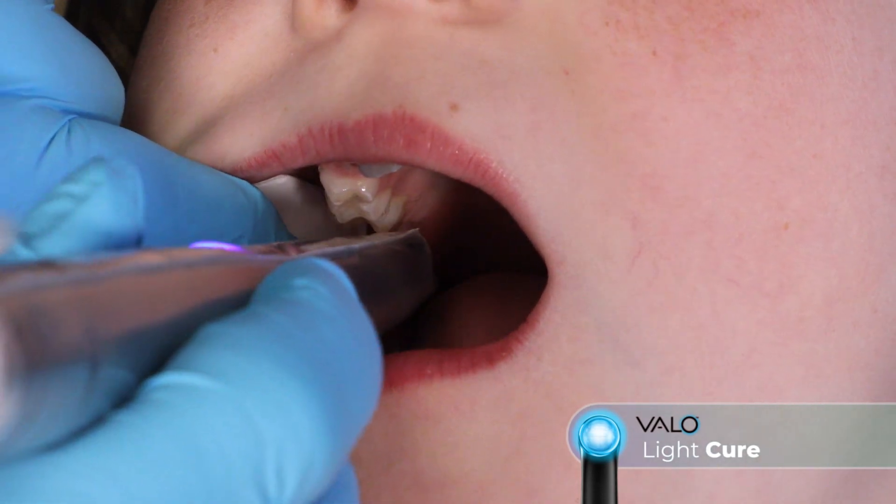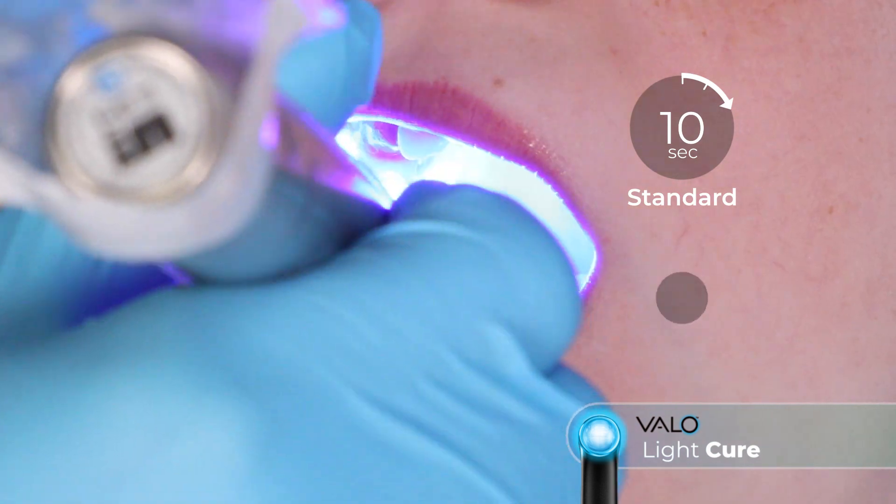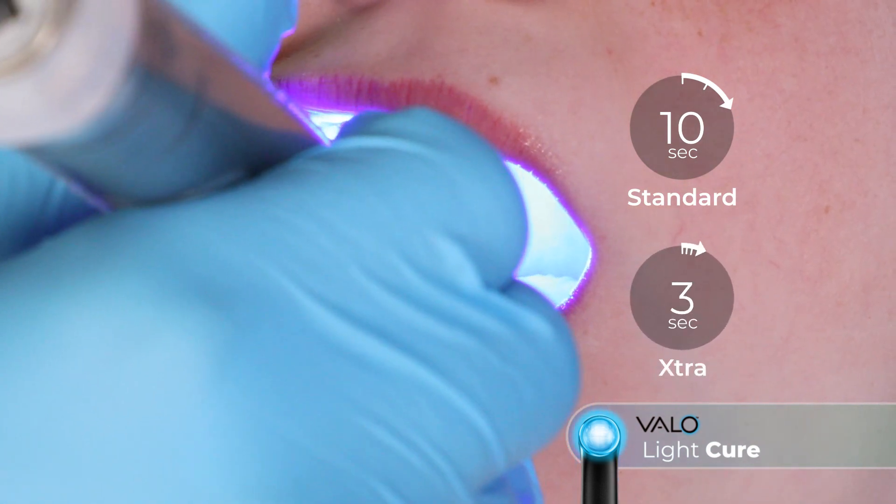Light cure the resin using a Velo LED curing light on standard power for 10 seconds or for 3 seconds on extra power mode.